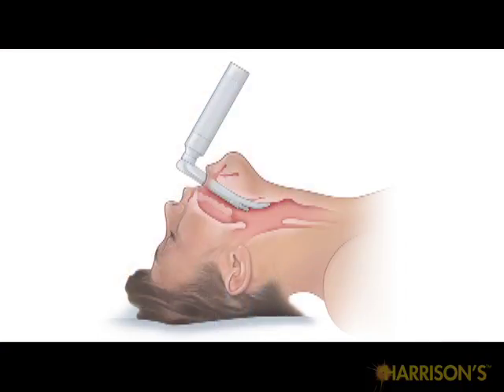Advance the laryngoscope past the tip of the epiglottis and pull up and forward at an angle perpendicular to the patient's mandible. The Miller blade should be placed posterior to the epiglottis and used to pull the epiglottis out of the way. Therefore, only vocal cords should be visible. The Miller blade should be placed between the cords and the epiglottis rather than between the vallecula and the epiglottis, as with the Macintosh blade.